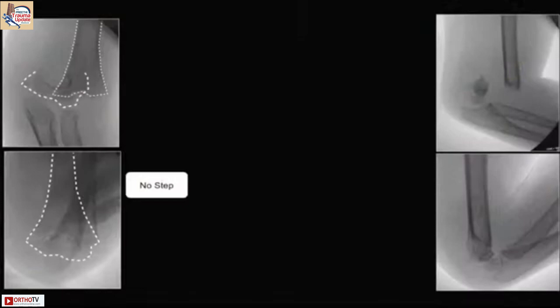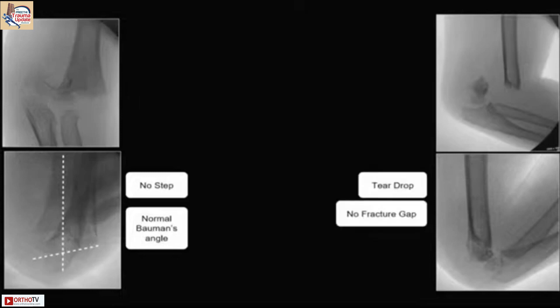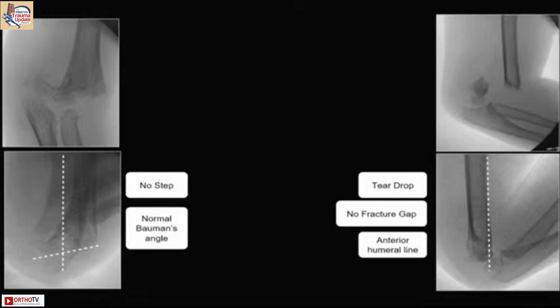At the end of reduction, check that there is no step, the Baumann angle is normal, the teardrop appears normal, there is no fracture gap anteriorly, and the anterior humeral line cuts where you want it — that is the continuity you are looking for.